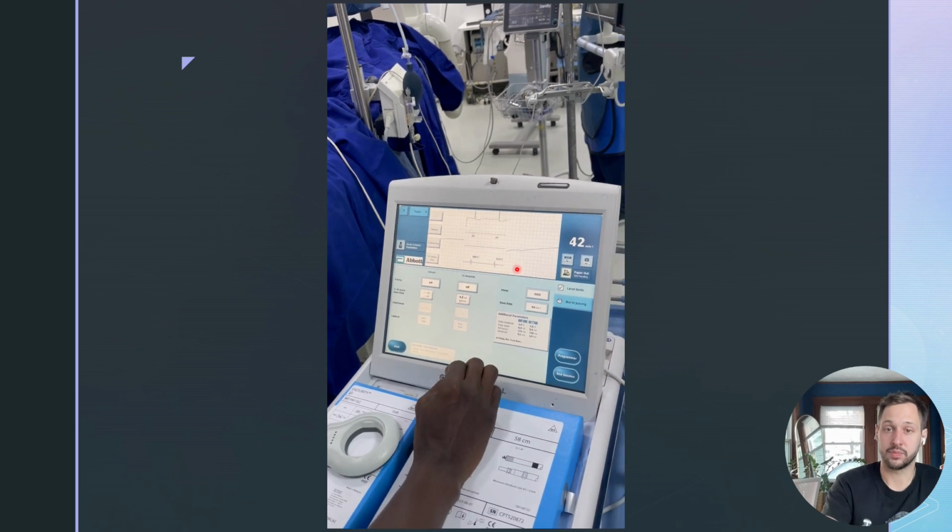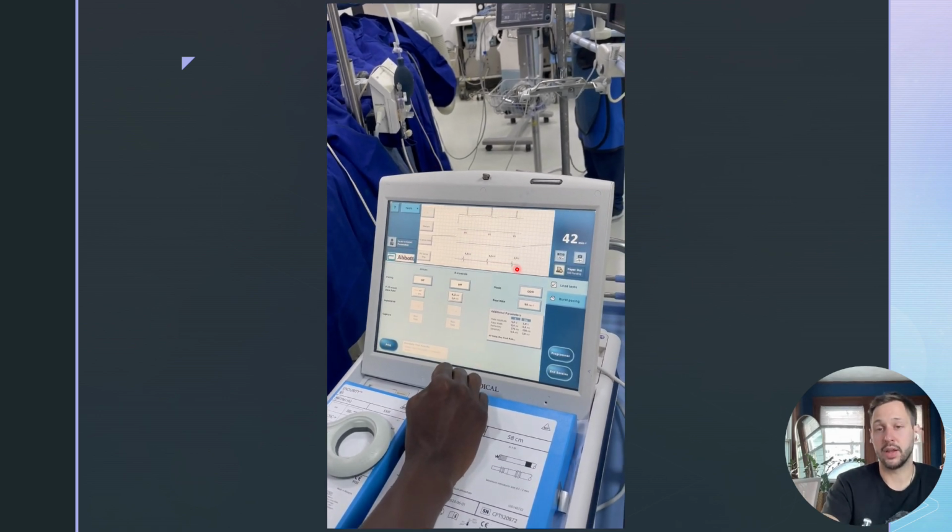Calls out the injury current. Moving along, RA 4.8, 4.5. Now he's calling out the sensing. Once again, vocalizing. Now we're saying how the sensing looks to the physician. Sensing values we'll talk about later.